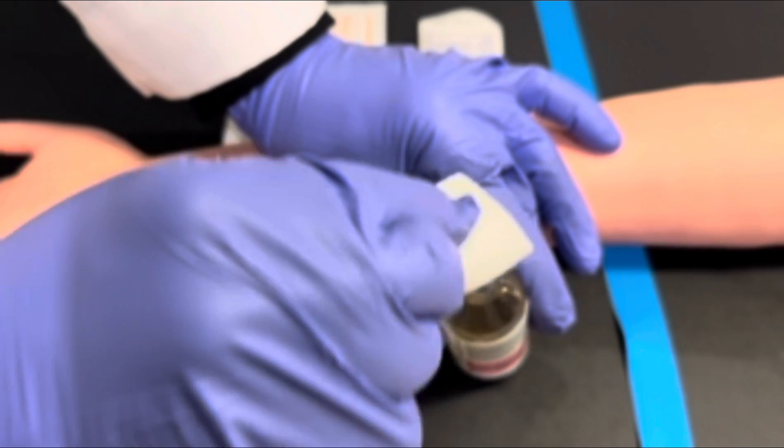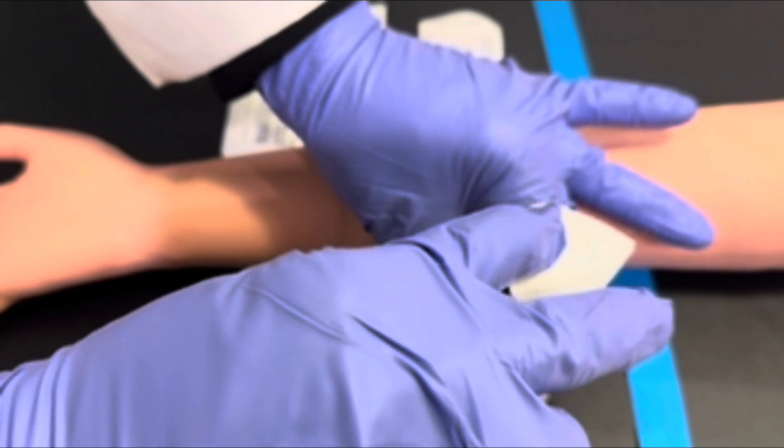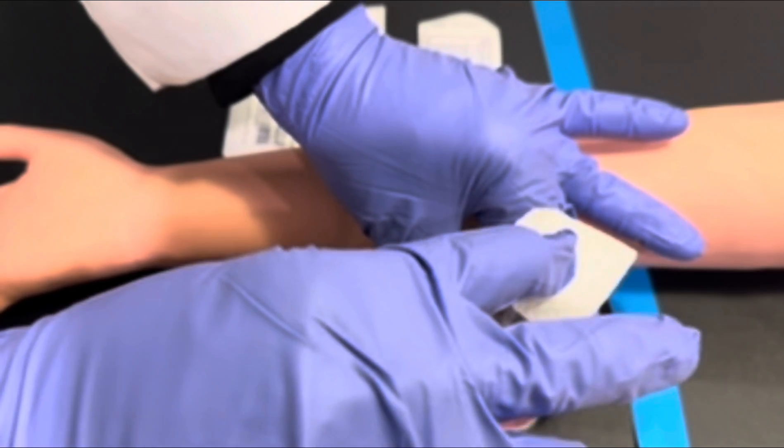Please clean the top of the blood culture bottle thoroughly and allow the alcohol prep pad to sit on top of the blood culture bottle.